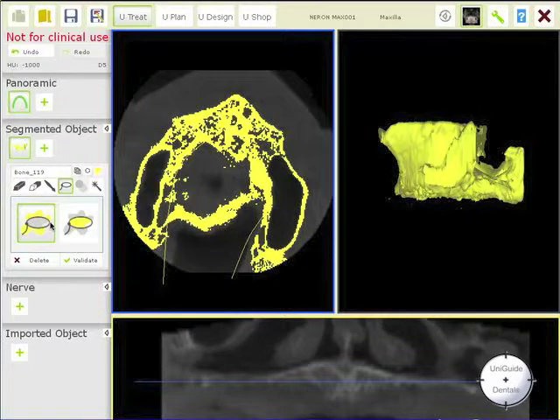I am going to be sure that I can see all the teeth and all the volume of this file, so I slightly increase my blue lines and I'm going to open it. Automatically the job is going to be done.